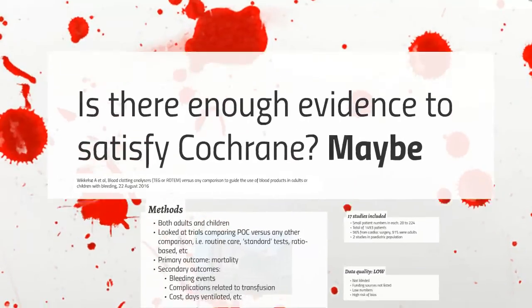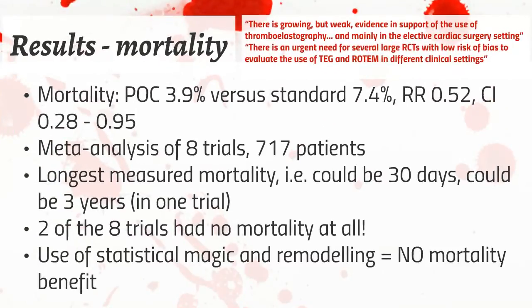They said maybe, essentially. So they looked at all these studies, and I'll just skip over to mortality. They did find a statistically significant reduction in mortality, but they still gave it a pretty lukewarm recommendation because the quality of the data was just so low, in their opinion, and there was lots of bias. Many of these studies are not controlled for in terms of their protocol.